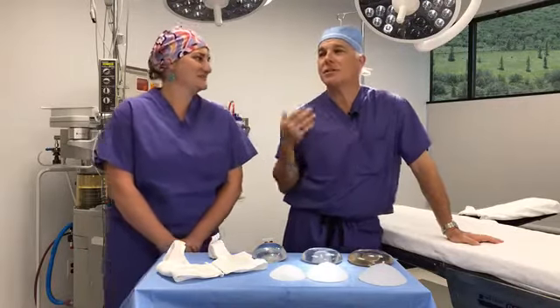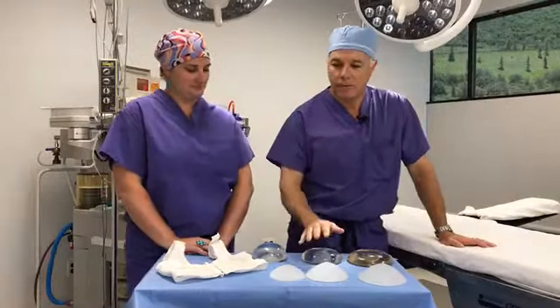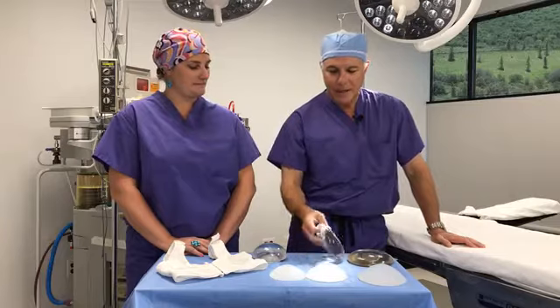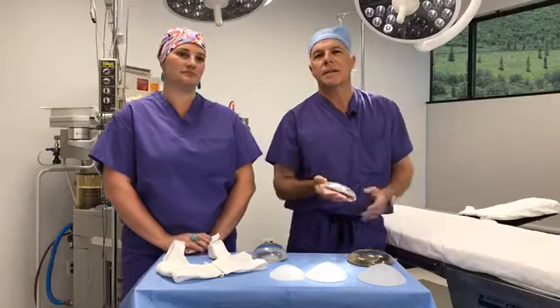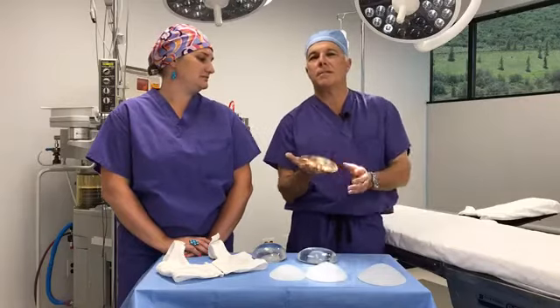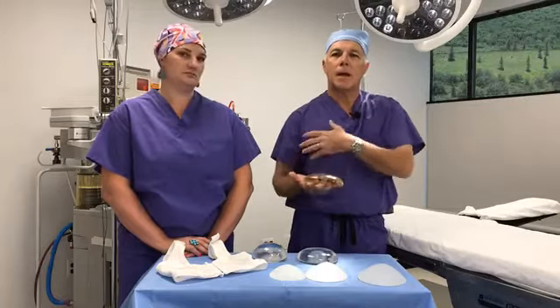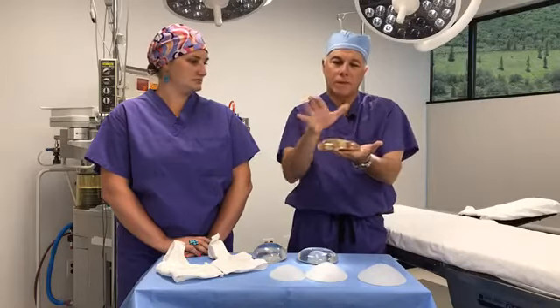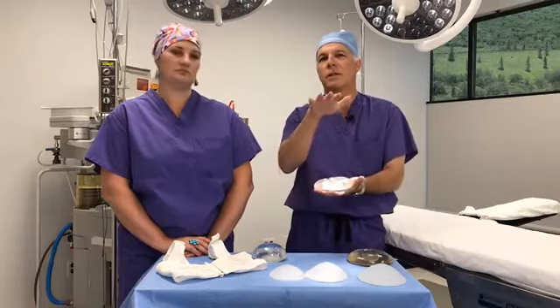Okay, so let's just say, Lindsay, for instance, wants a 350 cc implant. So we've decided, trying on sizers, that 350 is kind of where she wants to be. So my job is, a lot of people think the shape of the implant determines the shape of the breast. It's actually the opposite. So let's just say I'm going to use a 350 cc implant. This implant at 350 cc's may be too wide. So it might be too close to the midline. It might stick out under the arm. So my choices then would be use a smaller implant, which obviously would be less in all dimensions, or switch to a narrower implant that's going to have more projection.